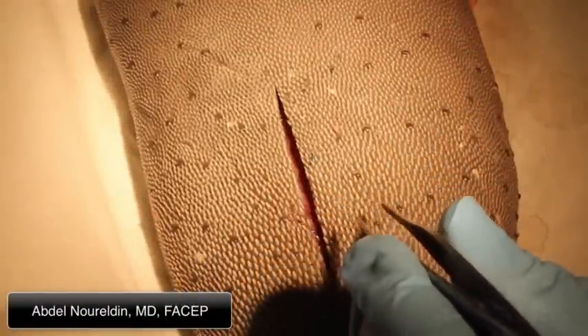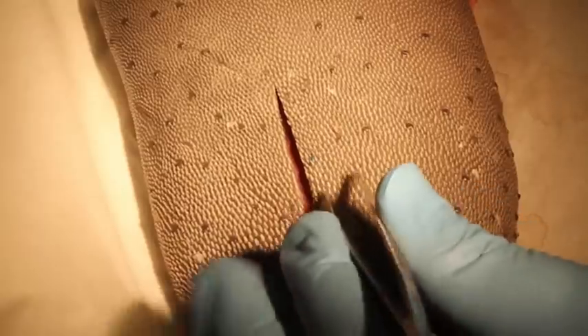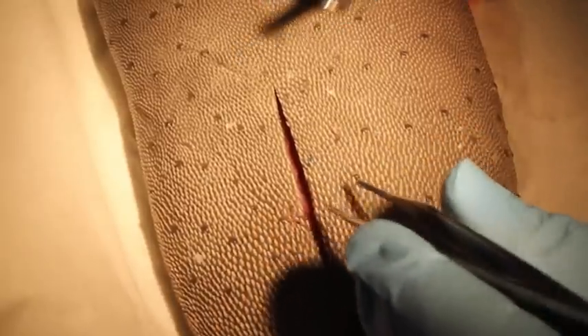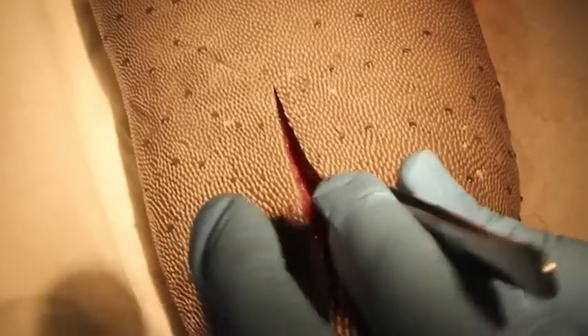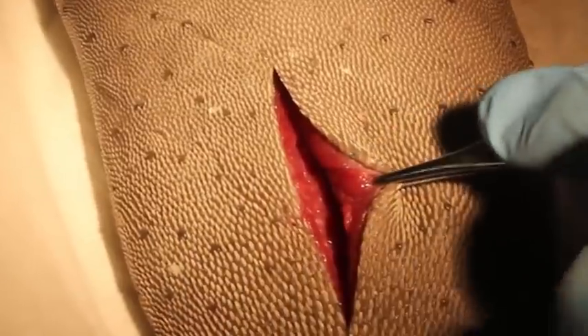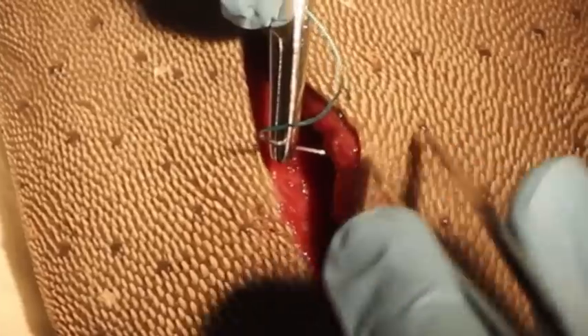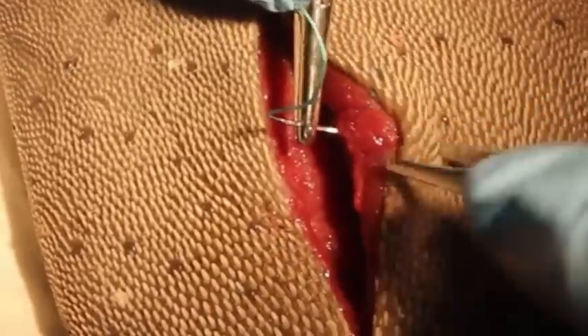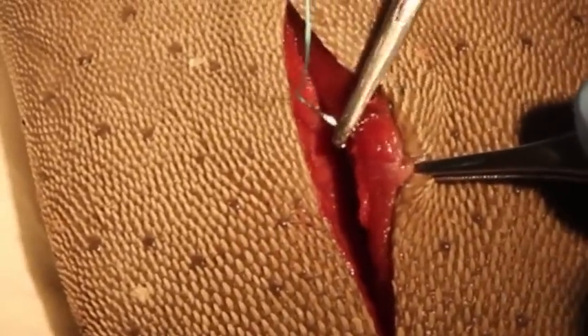We're going to show you how to put in a buried stitch. A buried stitch means the knot will be at the bottom of the wound. Fork and knife your needle holder and your forceps. Now we grab this side — we want to start from the bottom of the wound and come up right through that subcuticular area. See that area? This is where we want to come up.